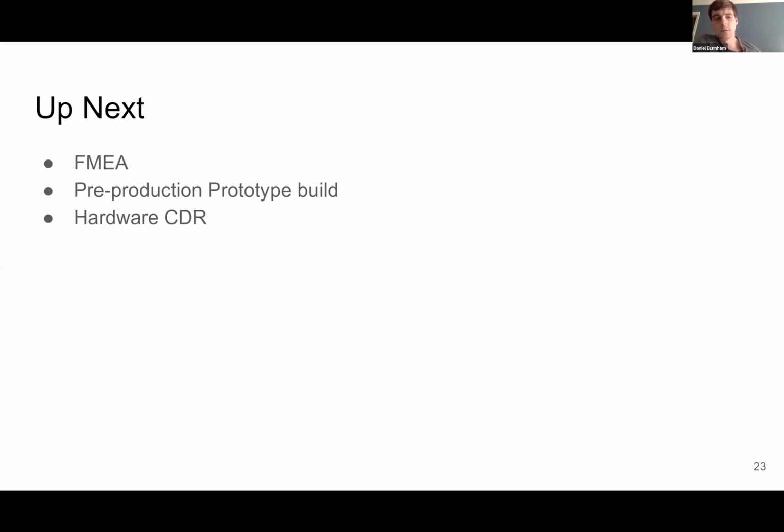So if you have something that's specific to the design, like a failure mode, just send that out or make a comment in the current FMEA. If you identify something like an overall hazard with the device, like it could harbor some infection or something like that, that isn't necessarily a design failure mode, let me know and I'll add that to the overall risk assessment of the device.